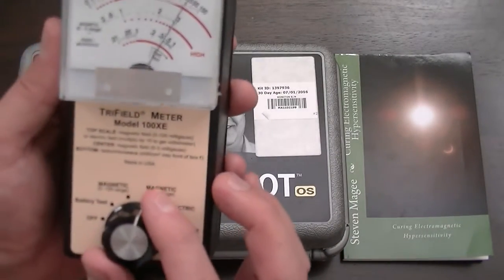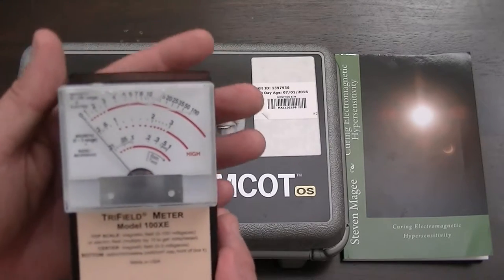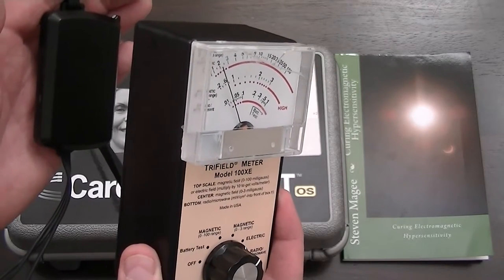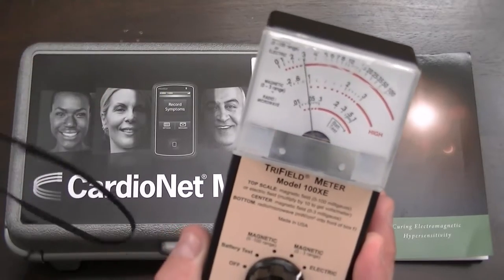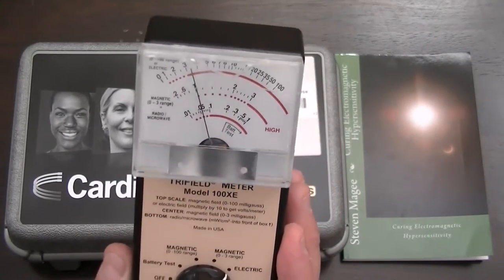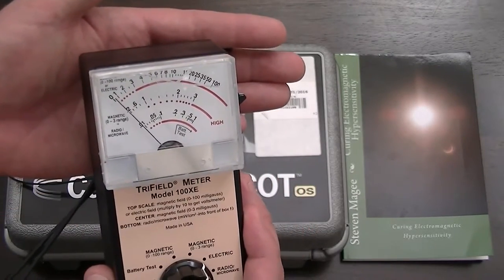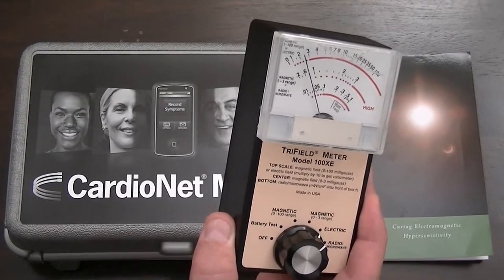Let's try the electric field setting. We can see that we have a pulsating field coming out of this unit. With a little bit of separation, we're still picking up that pulsation from the device. Some of this constant field is actually the electric field from my body — not the device itself. But when we bring it close, we start getting a pulsating field out of this device. Further away, we just get the ambient electric field from me.